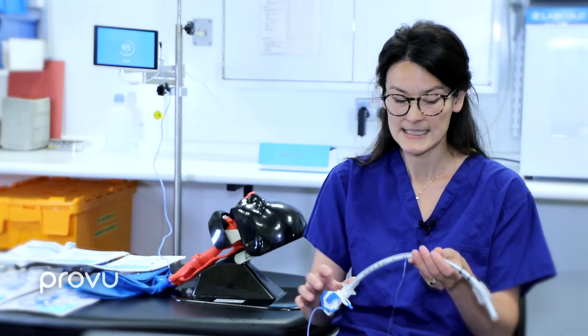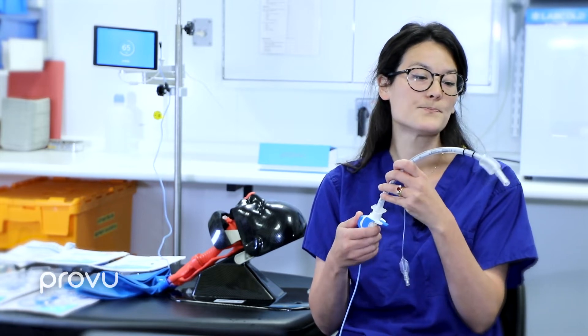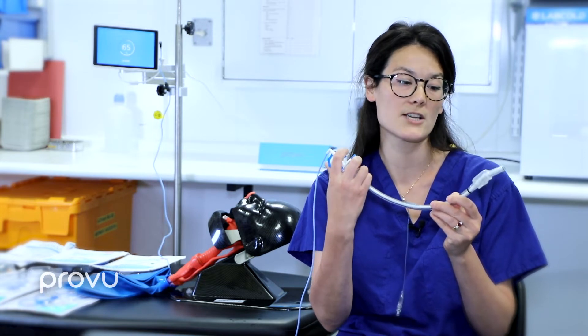So what is the ProVu intubating stilette? Its novelty is its manoeuvrable tip, which is manoeuvred using a bi-directional wheel at one end of the video stilette. It moves through flexion of 35 degrees and, what's novel, retroflexion of 60 degrees. This is aided via a softer polyvinyl chloride material situated under the cuff, which really helps with that manoeuvrability.